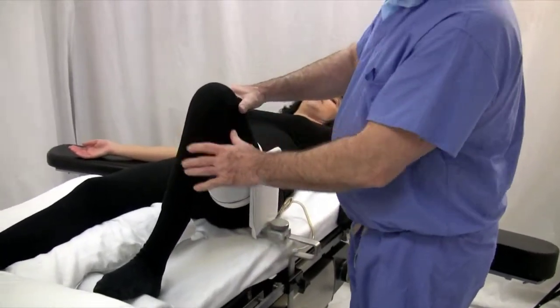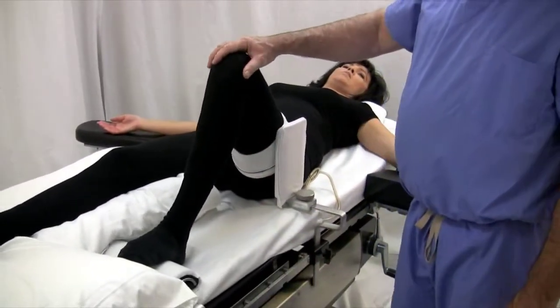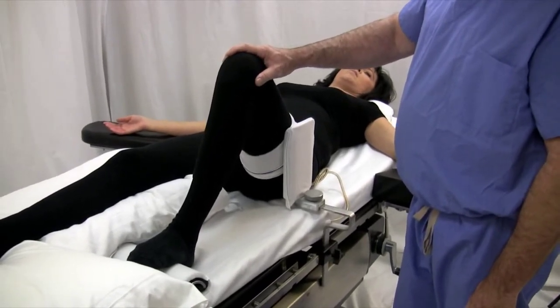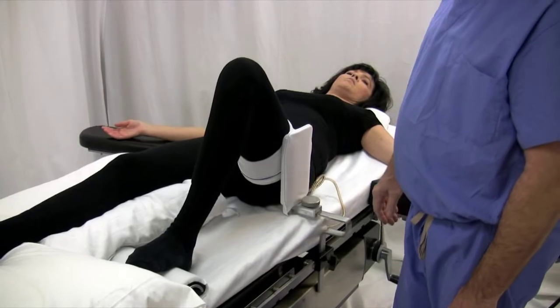Then at this point, under anesthetic, the patient's position will be held in the appropriate position without the need of an extra pair of hands.